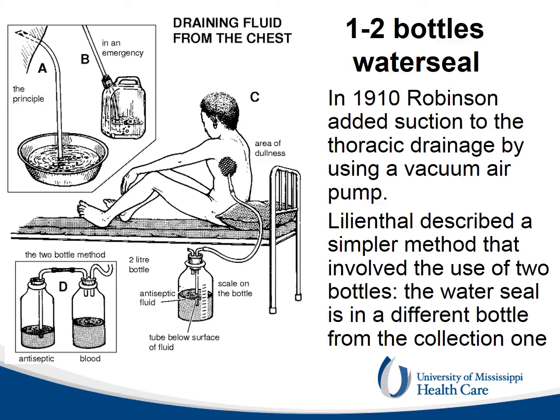The drainage system improved when Robinson in 1910 added suction to the bottle and when Lilienthal used 2 bottles instead of 1. This way, the level of the water seal did not change with the amount of drainage.